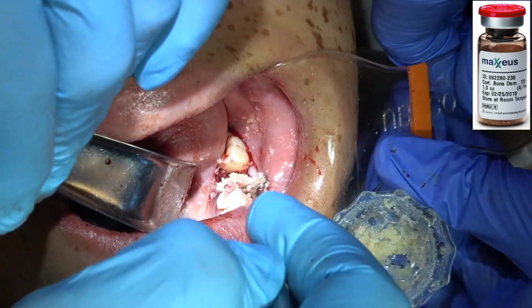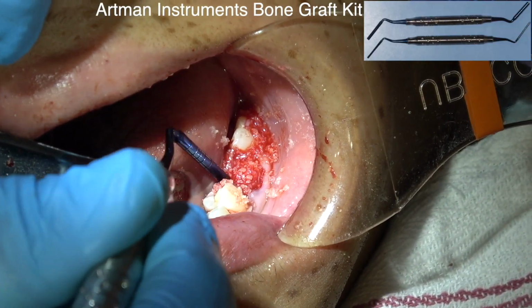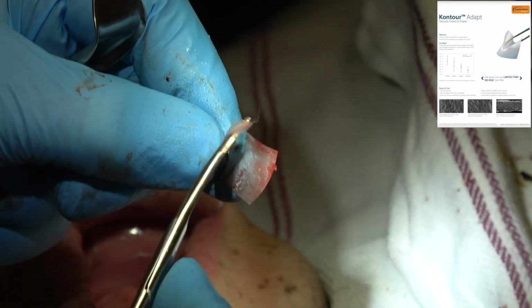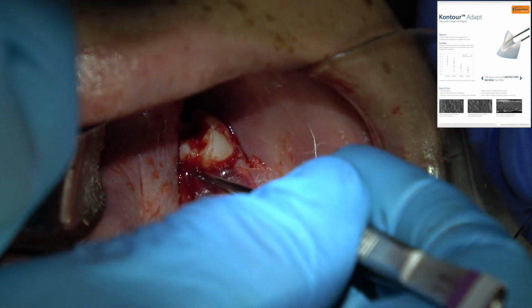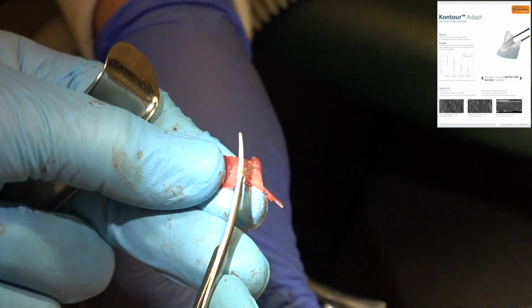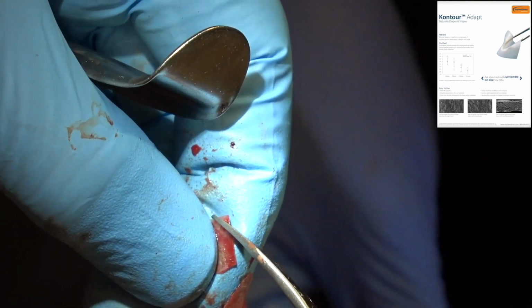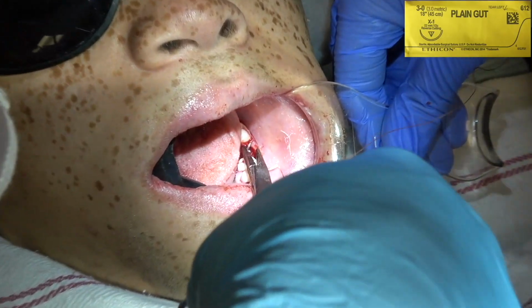So I'm using cortical bone, freeze-dried bone, Maxius. Wet the freeze-dried bone with distilled sterile water and then pack it into the extraction site and place either a slab of platelet-rich fibrin or resorbable collagen membrane over the grafted extraction site. And I'll show you how this works. You can watch my videos. See, here's the resorbable collagen membrane.